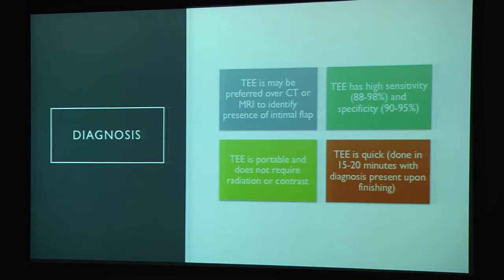And so just because of the ease of use, and sometimes just the technical aspect of who's going to be able to perform this, isn't someone that's there 24 hours a day, 7 days a week at our institution. And so a CTA is usually going to be the way to go with this.